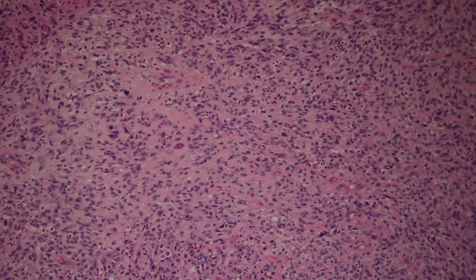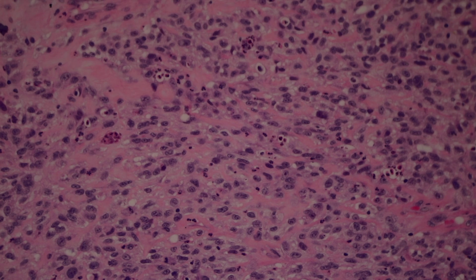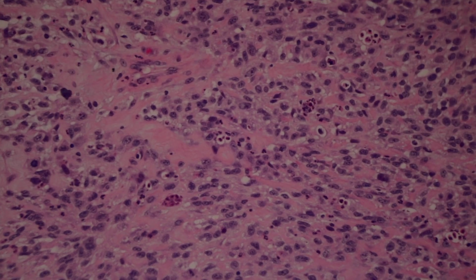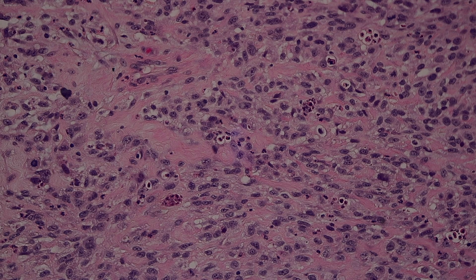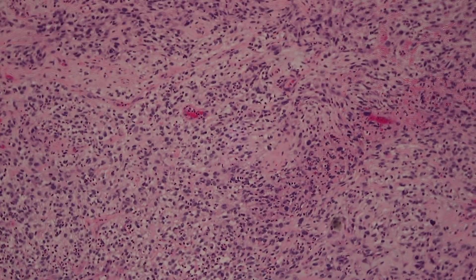a squamous cell carcinoma. In here, the cells get a little more oval to round, and so you could start wondering, well, maybe this is actually epithelial, but I've seen areas that look just like that in melanoma and in a variety of other tumors. So when you've got sheets of ugly cells that you really can't tell they're keratinocytes at all, and you think, I need to do immunostains to see if this is squam, usually that's the time when I'll say poorly differentiated. If it's so ugly that I have to do an immunostain to prove that it's squamous cell carcinoma, that's when I usually will use the term poorly differentiated, that it's so ugly I can't even tell for sure that it's keratinocyte without getting some help.